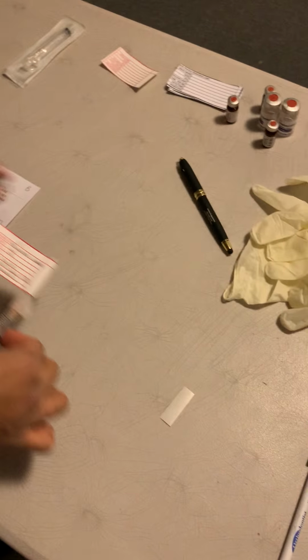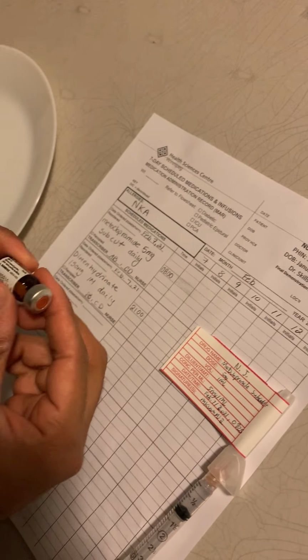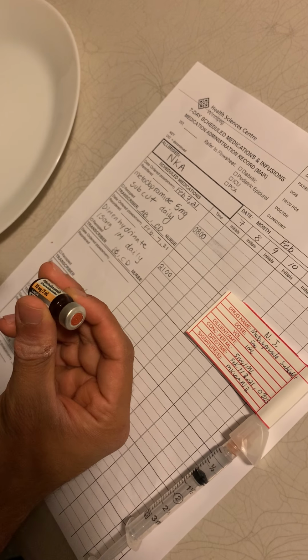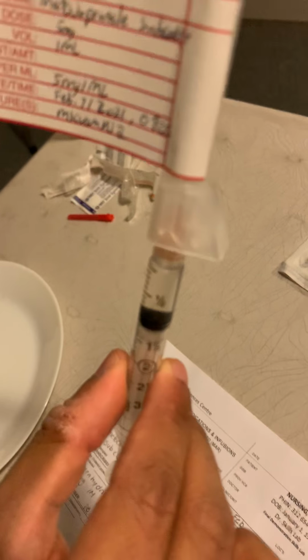Okay, now I'm going to do my second check. This is for nursing Jake. The medication name is metoclopramide. This is metoclopramide and metoclopramide. And the dose of the medication is 5 milligrams. This vial did come in 10 milligrams per 2 ml, 5 milligrams per ml, which is why I have 1 ml of medication in this syringe.